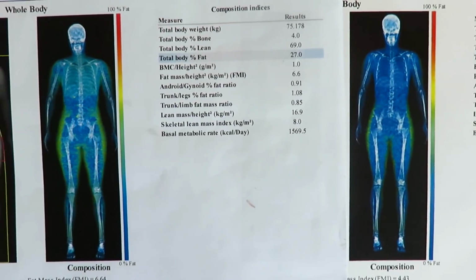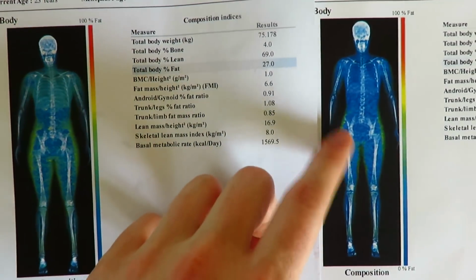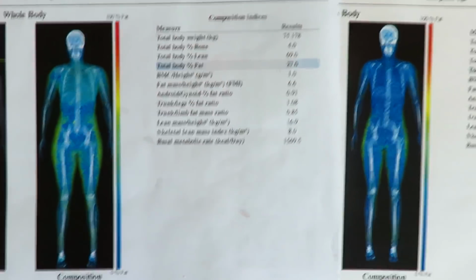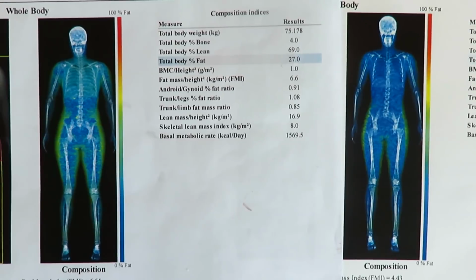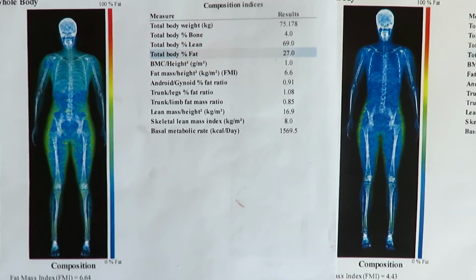And you can actually see, just even looking at that, there's less. What's happened to my hips? What's happened to my booty? No, come back. But you can see that I've just generally lost fat from all over. I think it's a good comparison just to see that you can't spot reduce. I've basically lost fat evenly from all over my body.